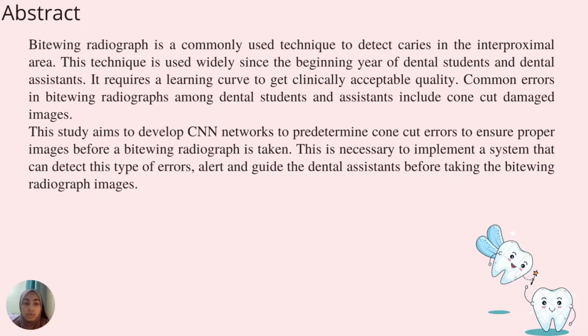This study aims to develop CNN networks to predetermine cone cut errors to ensure proper images before a Bitewing radiograph is taken. This is necessary to implement a system that can detect this type of error, alert and guide the dental assistants before taking the Bitewing radiograph images.